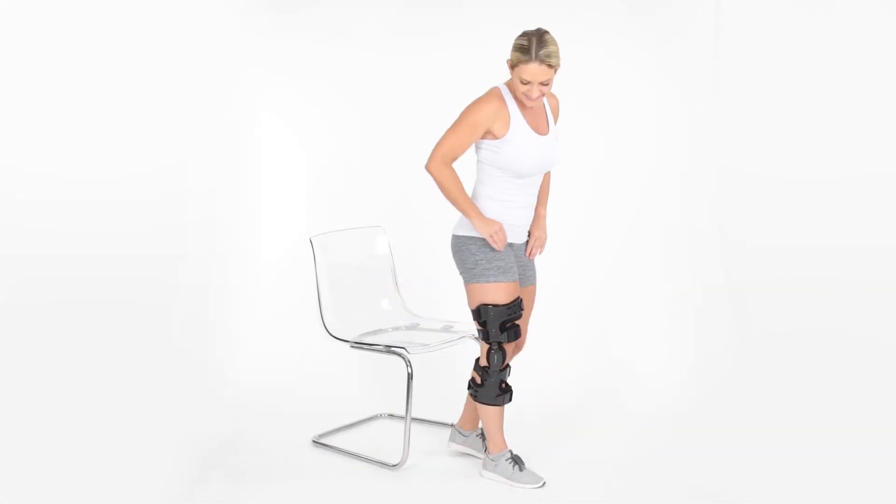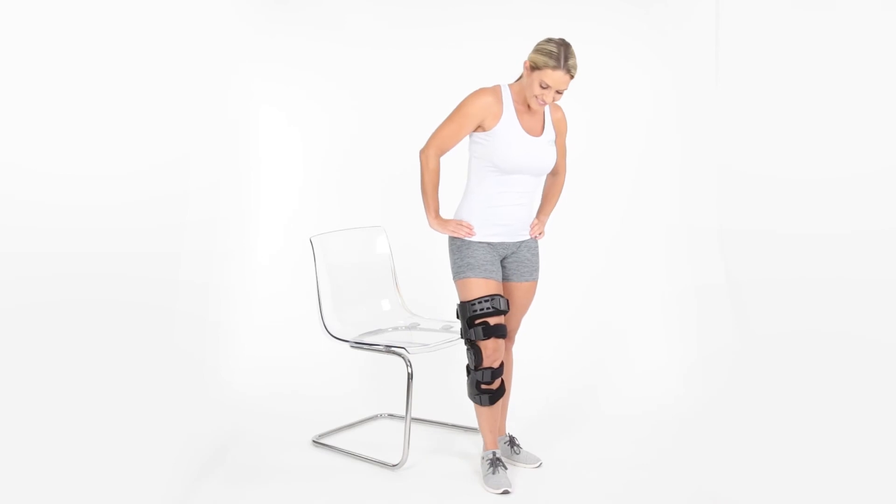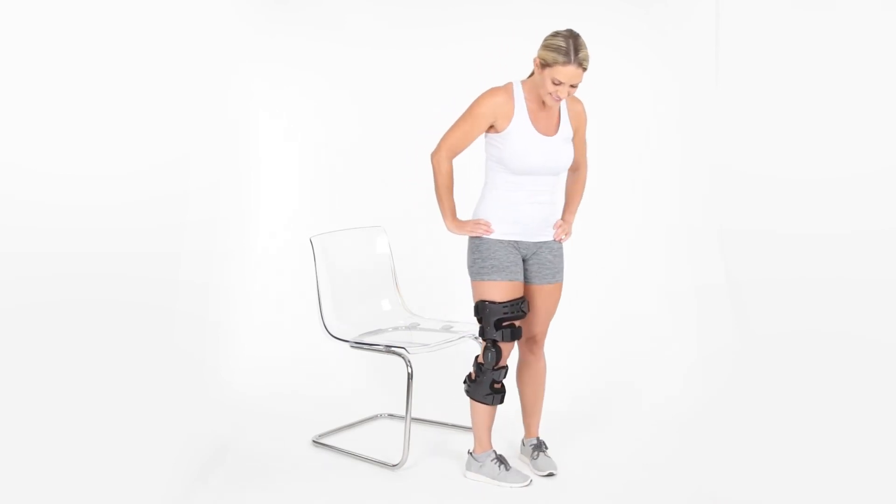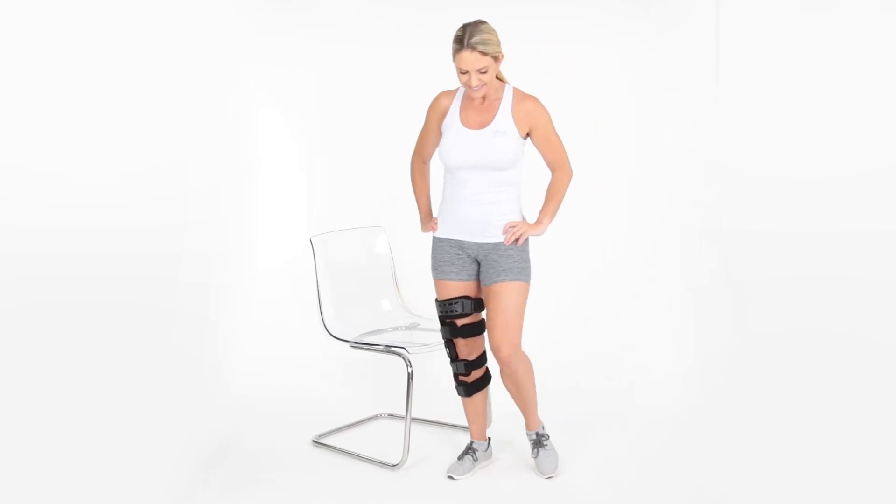Stand to check the tightness of the brace, and walk around bending the knee to check if the brace slides or causes any discomfort. If it does, readjust the straps while seated, and retest.